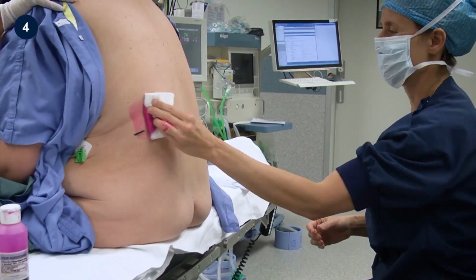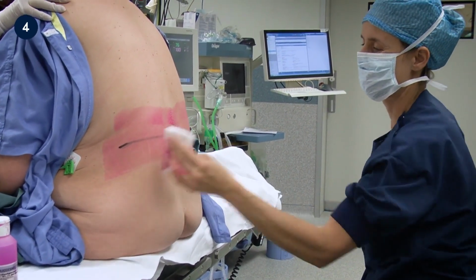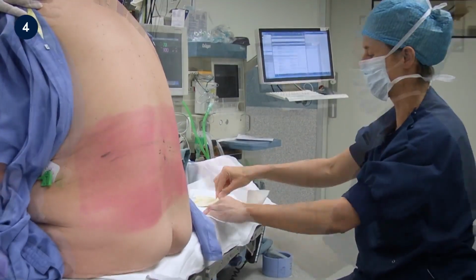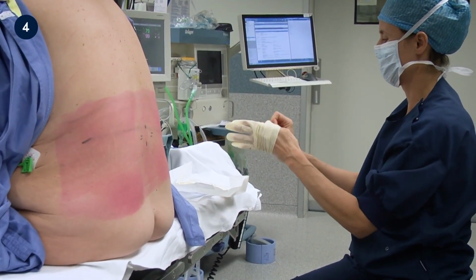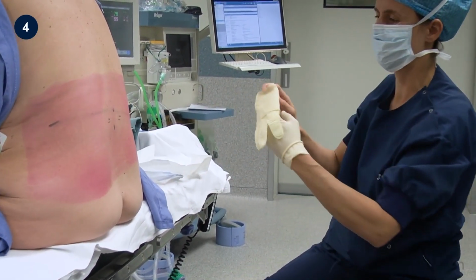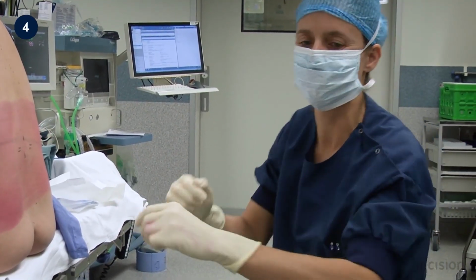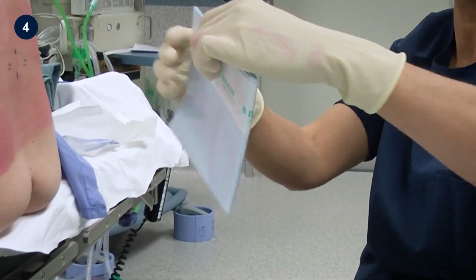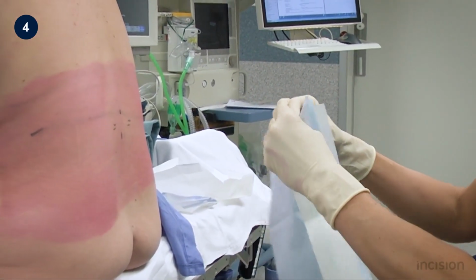Cleaning of the skin begins over the intended injection site and then works outwards away from it. The solution used typically contains chlorhexidine. While the anaesthetist puts on the sterile gloves, it is allowed to dry. This is because chlorhexidine is neurotoxic and should not be allowed to enter the subarachnoid space. The sterile drape is now positioned to cover the skin caudal to the injection site.